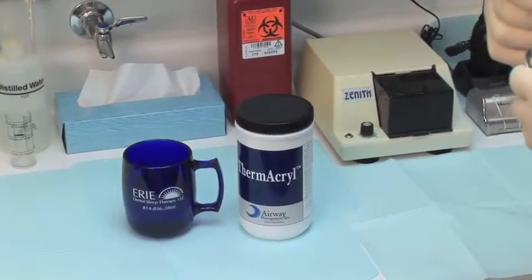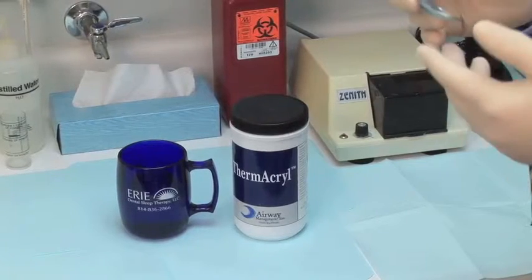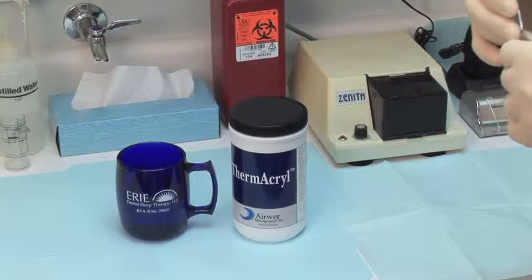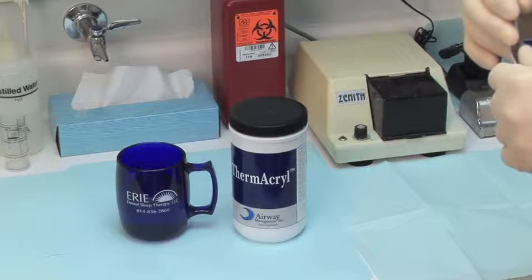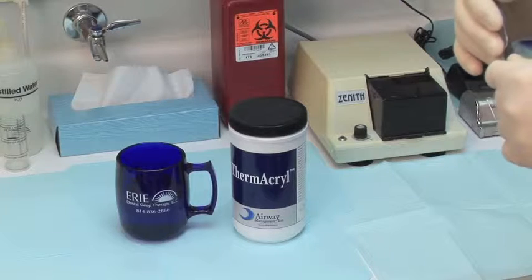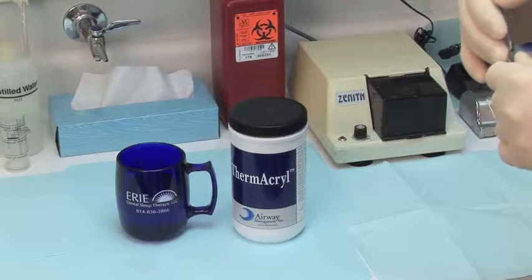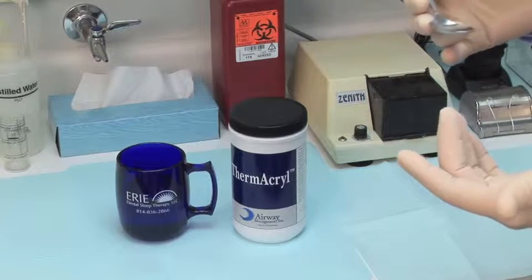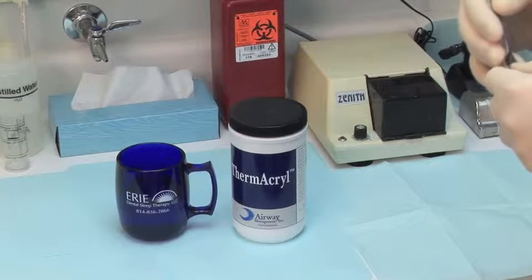I'm going to give you instructions on how to fabricate what I call a Centric Occlusion Repositioner, or as you'll see in the instructions, it's called a Bite Exerciser. It's a very simple technique. We found it to be very effective in helping patients in the morning to have their jaw joints and all the muscles relax.